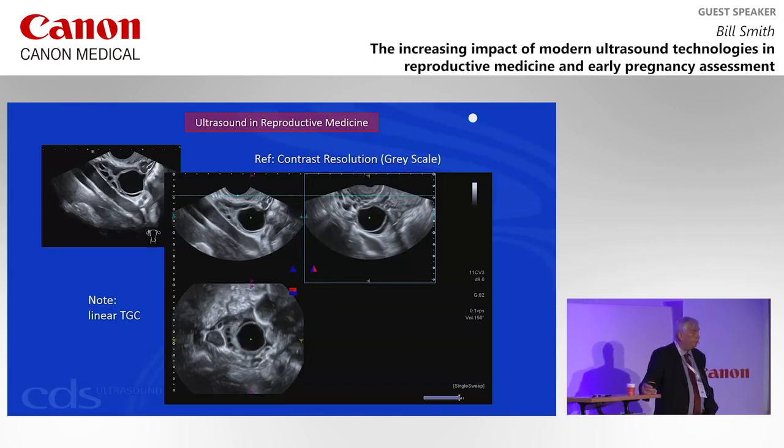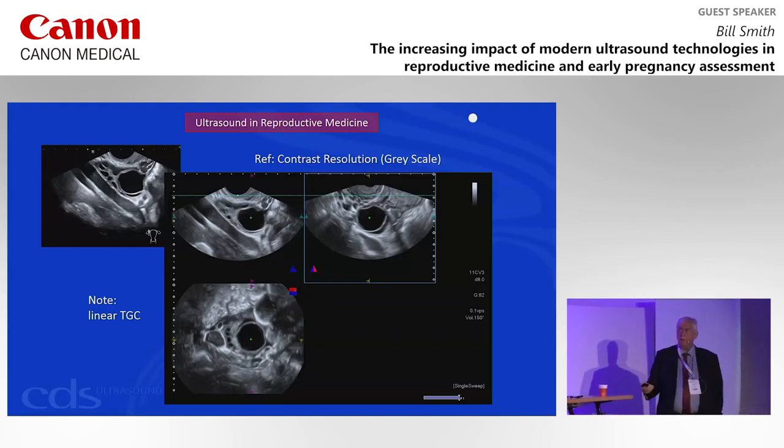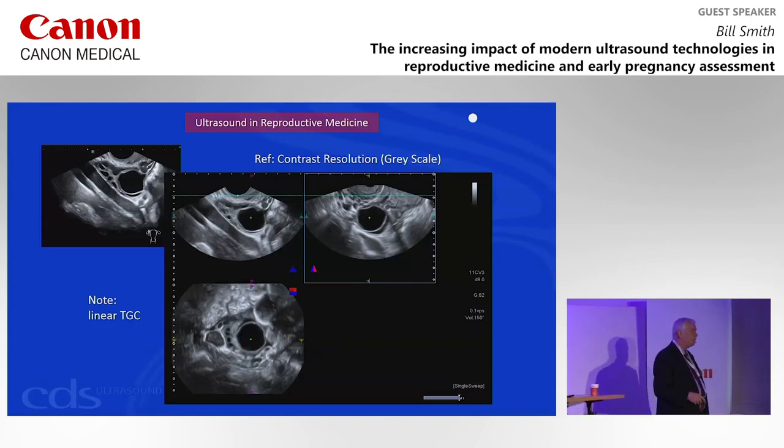In terms of looking at the adnexal region, it's an ideal area to check Grayscale. If we look here, this is our dominant follicle, a developing follicle. In 80–90% of cases, we should be able to see the follicles clearly, the stroma clearly, and also blood flowing through the internal iliac vessels.